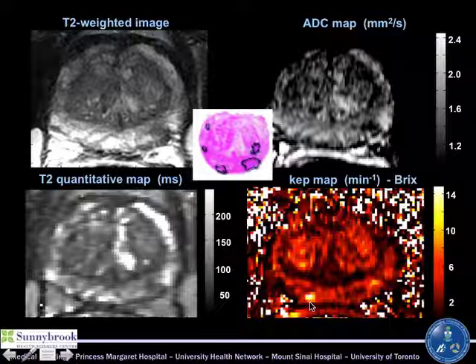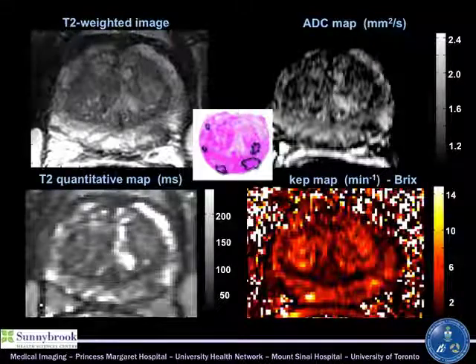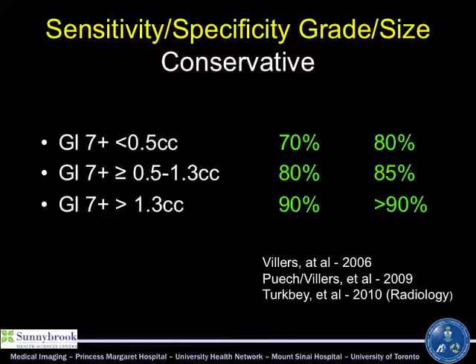So when we look at the pathology, we see, yes, we identified 2 of the lesions in the peripheral zone, but we missed 3 others. Is that significant? I would argue no, that it doesn't matter that we missed the other 3, that the driver lesions are going to be probably the largest one, or at worst the next largest one, in terms of this patient's prognosis and outcome. So if we biopsy the larger one and get the Gleason score on that, I would argue we've done a big part of our job in terms of improving patient care.